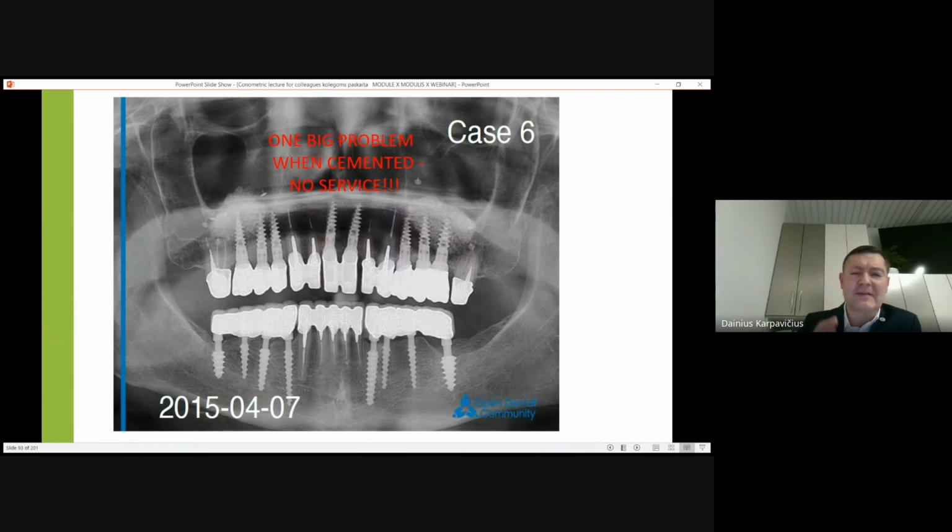You can sometimes not understand whether it is the metal of the abutment or the metal of the bridge. Even today, maybe it's easier, of course, while we have zirconia, thanks God. But anyway, to cut everything is very difficult. And if you imagine you put a crown or a bridge, and after 1 week or 1 day the patient comes and says, oh no, the color is bad, or something with the occlusion is bad, and everything is cemented in the mouth, what to do?